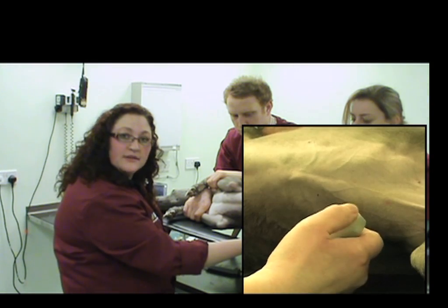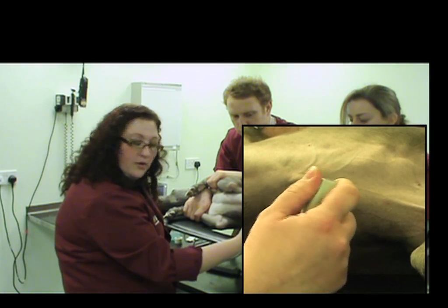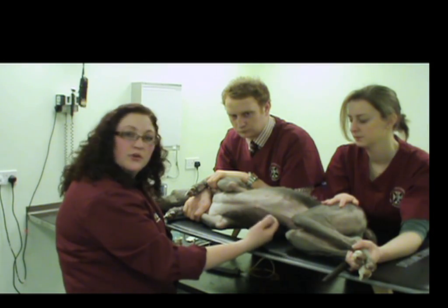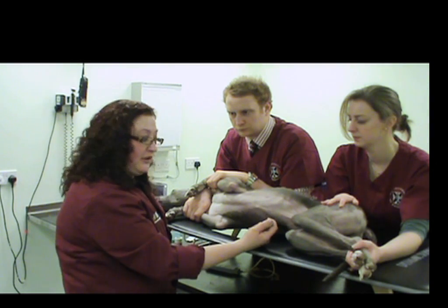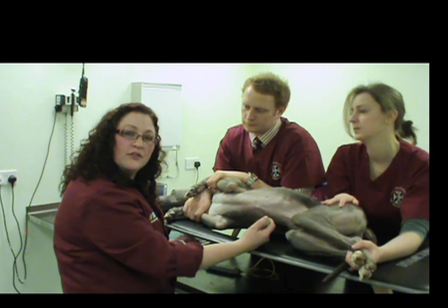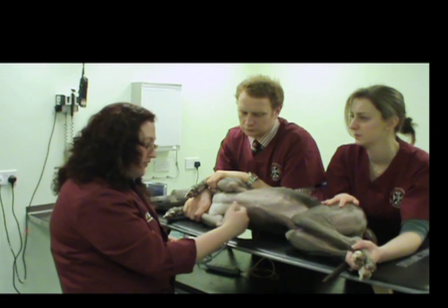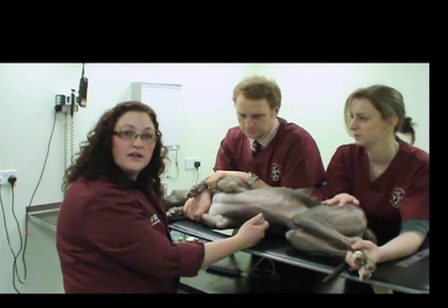The way that I will hold the probe throughout the exam is with my thumb on the thumb notch, grasping the probe quite near the footprint. That way we'll have really good control over where exactly we're moving the probe. Whenever you're performing a cardiac exam, the movements are very, very slight compared to an abdominal ultrasound exam, but they make a huge difference to what you're seeing on the screen. It's a two-dimensional slice of a 3D structure, so it's very important to get it in just the right plane to evaluate everything you want to see. So we're ready to get started now.